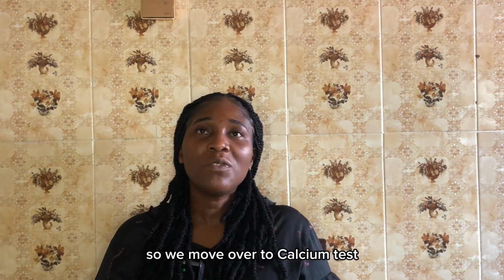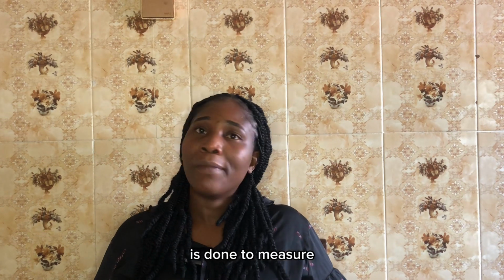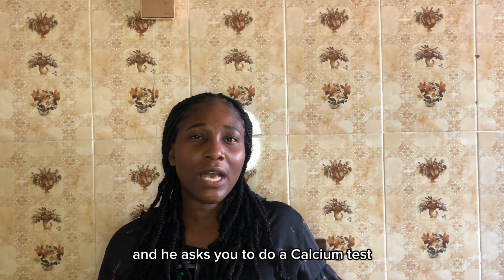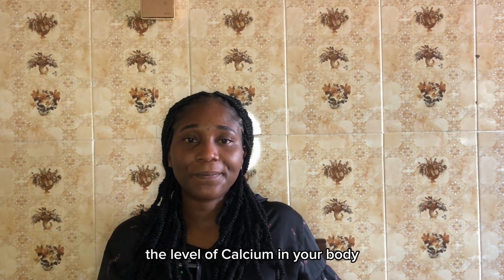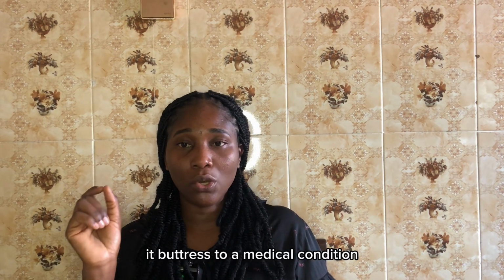Yes. So we move over to calcium test. Normally, calcium test is done to measure the level of calcium in your blood as a patient, as an individual. So whenever you come to the doctor and he asks you to do a calcium test, he wants to know the level of the calcium in your body. And also, if the calcium is too much or too little, it buttresses a medical condition.